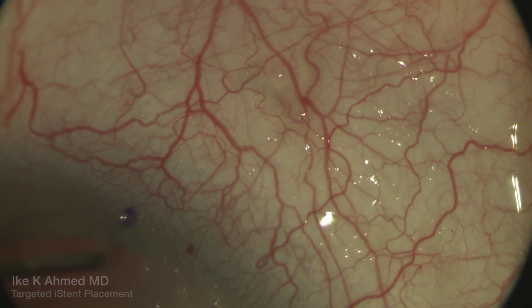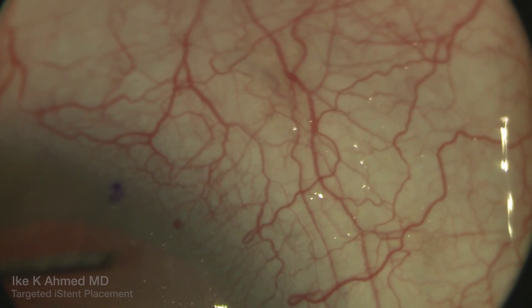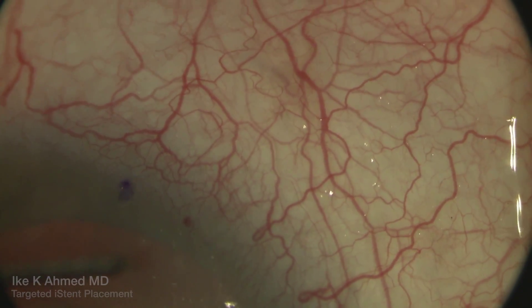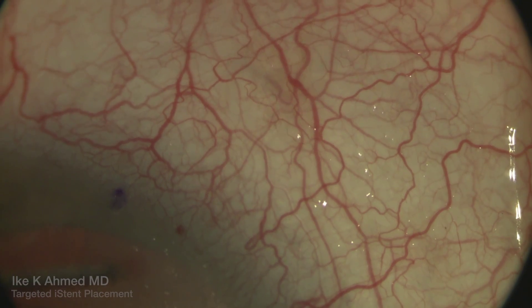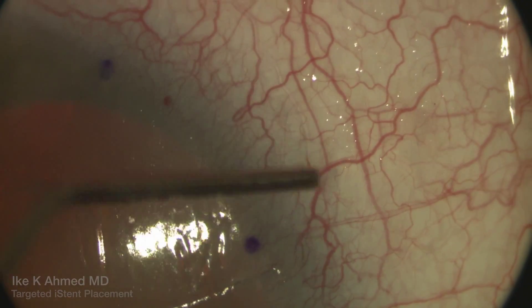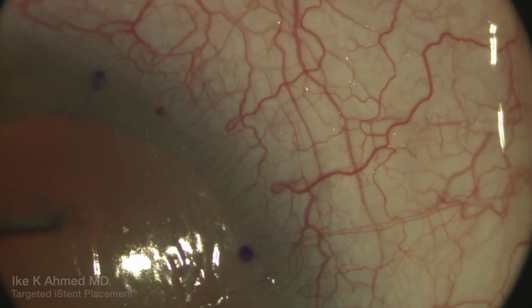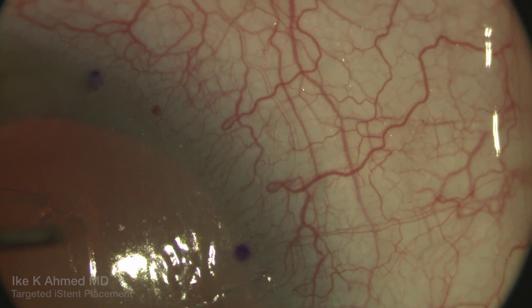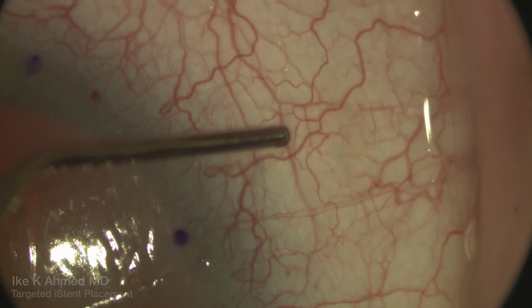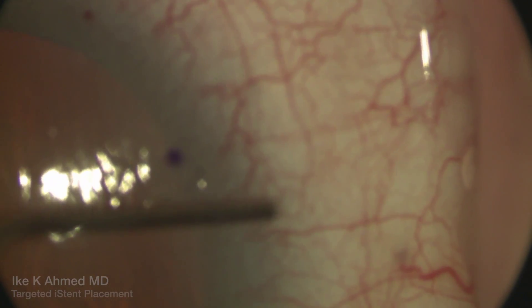It's really nice to see the distribution here. You'll see certain areas of very obvious aqueous flow into these veins, and a very nice example of laminar flow on this vein emerging from the limbus in this area, which has been marked already. Identification of these areas is important as we attempt to target these trabecular micro-bypass stents in the canal.